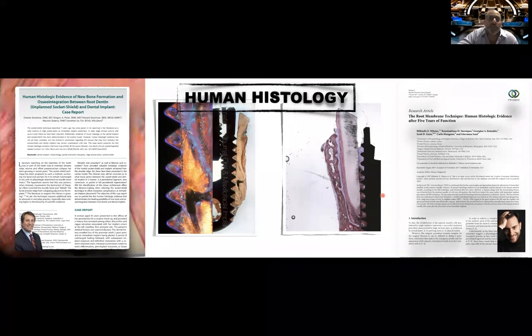It's great that we have some human histology to validate this. And it's not a partial extraction therapy lecture per se, so I don't want to get too detailed into the concept of what partial extraction therapy is, except to say that we're retaining part of that buccal plate, and we are going to have a remaining shield, so to speak, or membrane of tooth that's going to remain to help keep this periodontal ligament intact.